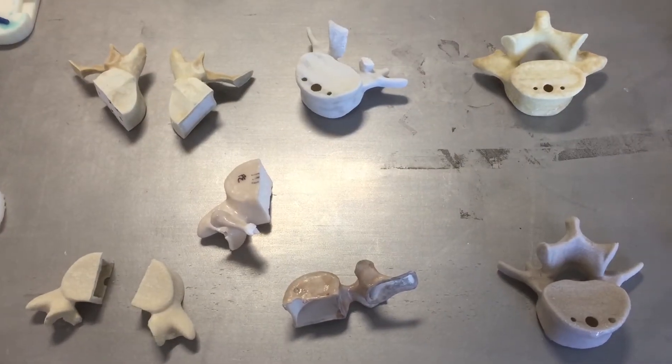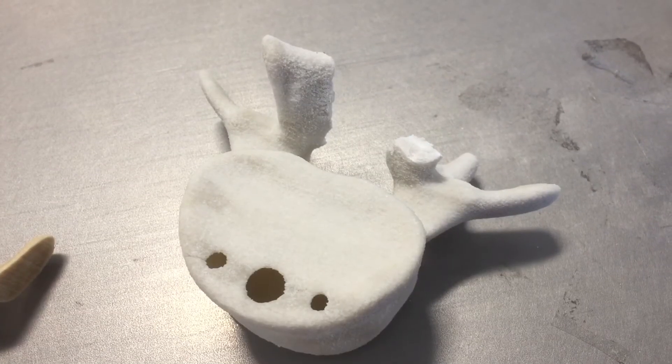We make them through a 3D printing process and we've developed a certain mix of materials together that really feels like bone, and we've checked the ingredients with the surgeon.